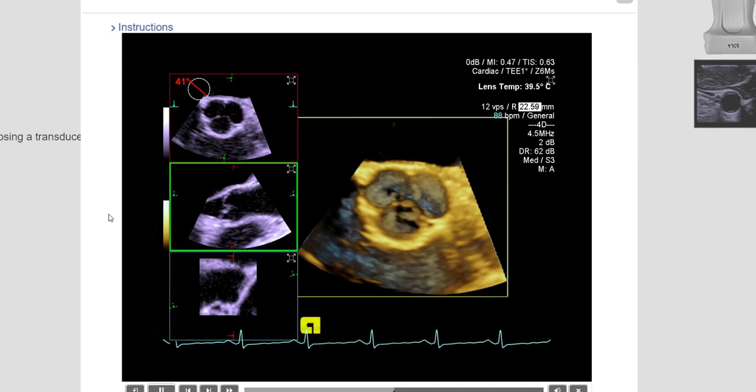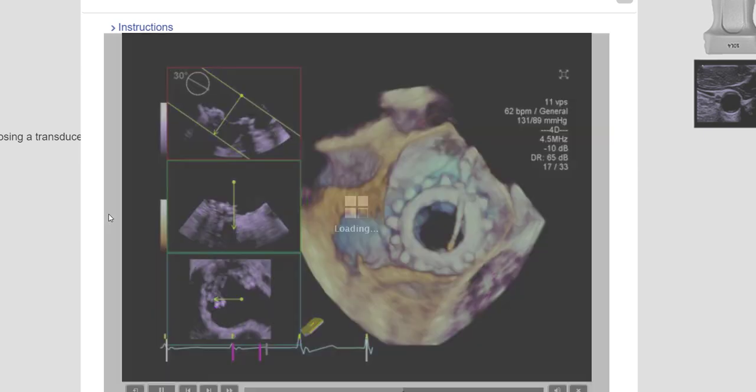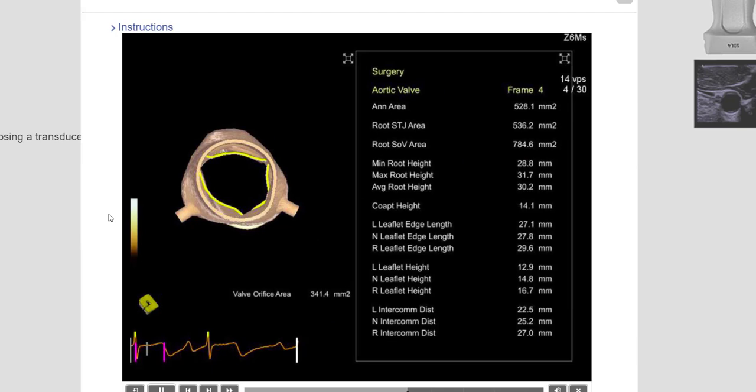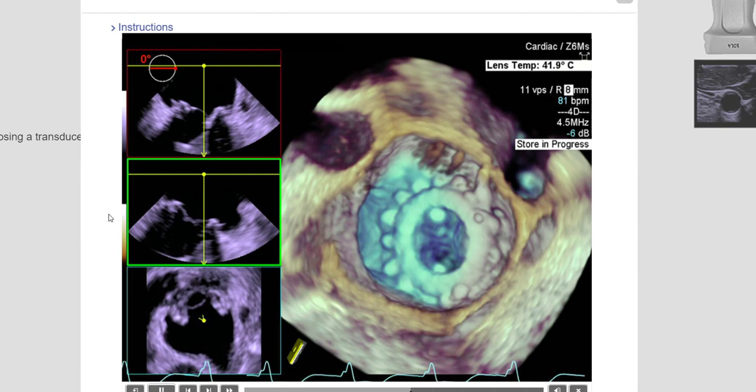Multiple slice planes collected within a cardiac cycle form a volume of ultrasound data and volumes per second, instead of frames per second. The operator then dissects or renders through the planes within the volume to reveal the structural anatomy of heart valves and chambers in 3 dimensions. Volumetric TEE transducers have revolutionized cardiac valve surgery. Specialized en-face or surgeon views are rendered from volumes that show superior detail and help plan and execute surgical intervention.